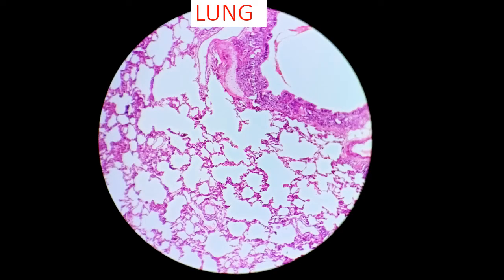Then moving to the lung, how to identify the lung? Lung is also very easy. Here we can identify the alveoli. These are all the alveoli, and here you can see the intrapulmonary bronchus. Here you can identify the hyaline cartilage, and these are all alveolar ducts. These are alveolar cells, type 1 and type 2 alveolar cells. And in some places you can see the terminal bronchiole, where you can identify the mucosal folds. So under the identification points, what to write: intrapulmonary bronchus can be seen, hyaline cartilage can be seen, alveolar cells can be seen, and terminal bronchiole can be seen, which has the mucosal folds. Okay, so that's about the lung.